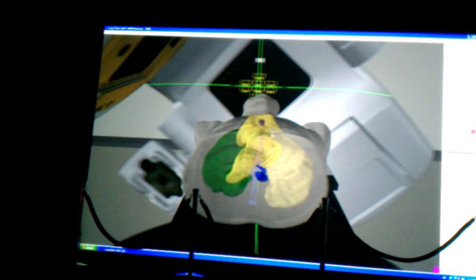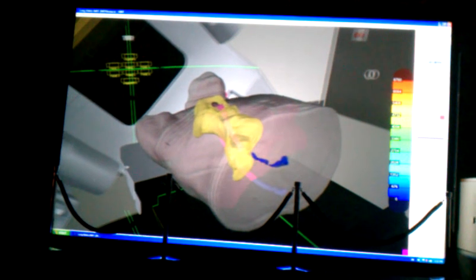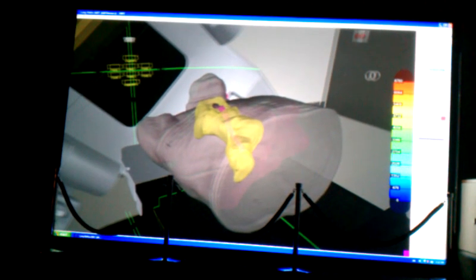While Kamika's doing that, let me tell you another thing that I think the radiographers in the room will really like. I can see it in 3D on my computer. It's called image-guided radiation therapy. What we will do is take radiographic images before the patient is treated. We set the patient up, get them exactly where we think they should be, then take a couple of radiographs. Then we can superimpose the digital radiographs that we just created over the radiographs that were done the first day when the patient was simulated, and line the 2 images up on top of each other.